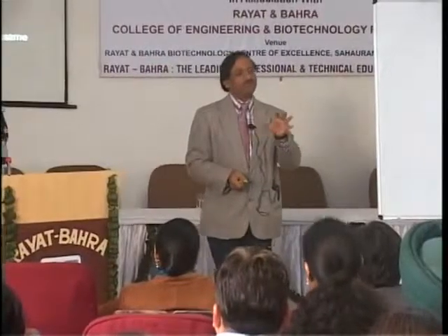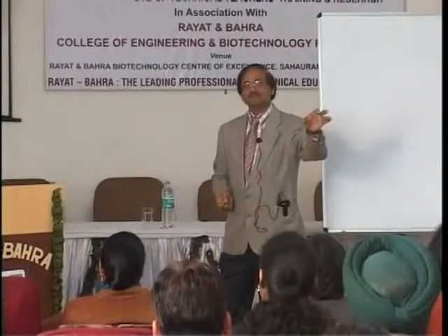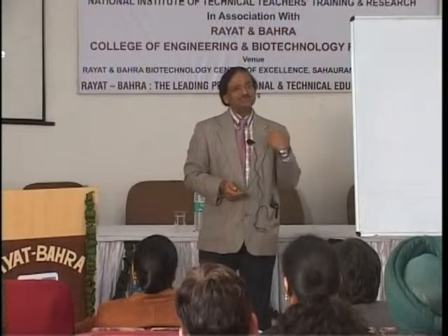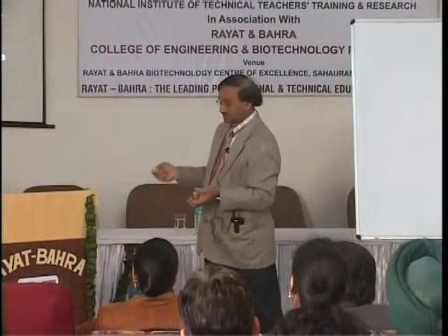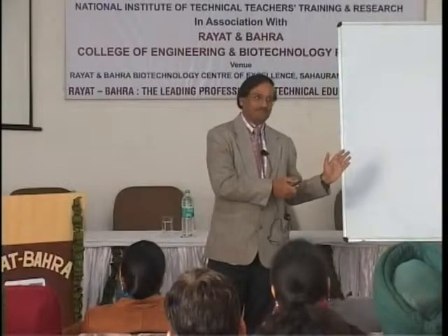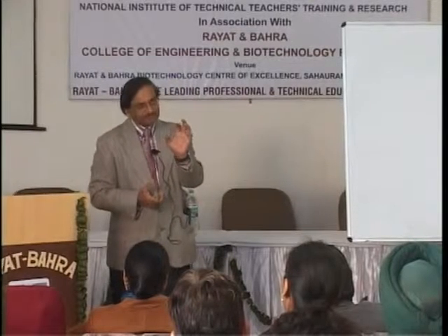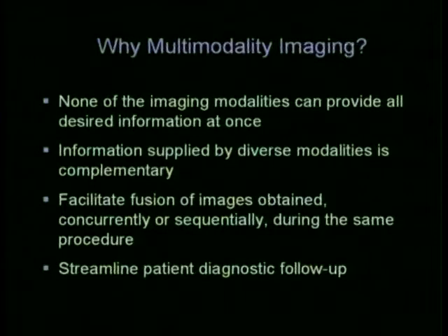Why do you need to do a multimodal? You have a CTA placed in one corner, an MR placed in one corner, ultrasound, clinics; you don't need it. Basically, your images come, you read those images and get the information. But you need it because not a single imaging modality will give all the information that a clinician wants to have. Whenever you need complete information, a single modality cannot give you the answer. So you need to do something more than what you are getting from this.